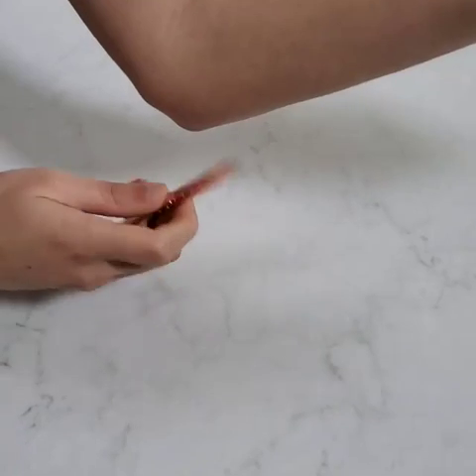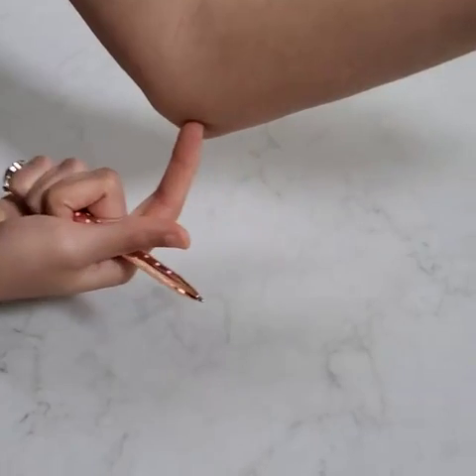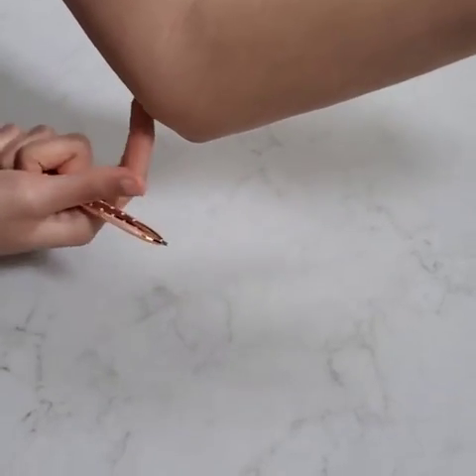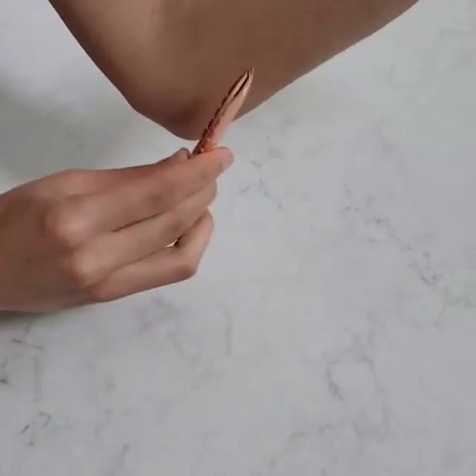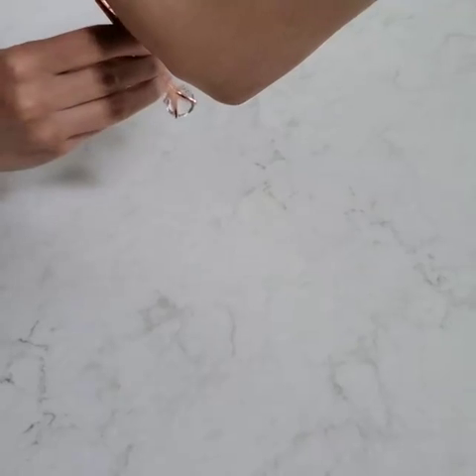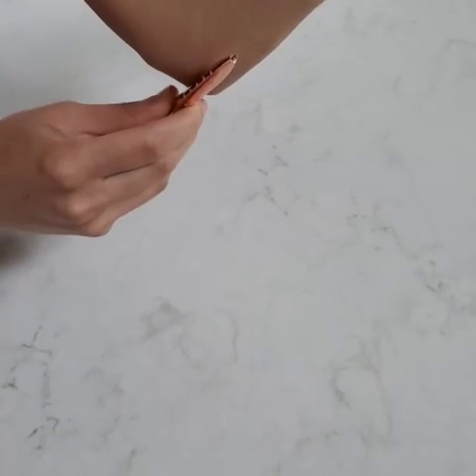Then you want to stimulate below and above the elbow — you want to have at least 10 centimeters distance. You're looking for cubital tunnel. So you stimulate here and then here. The ulnar nerve runs through this cubital tunnel between the medial epicondyle and the olecranon. That's your ulnar motor nerve conduction study.